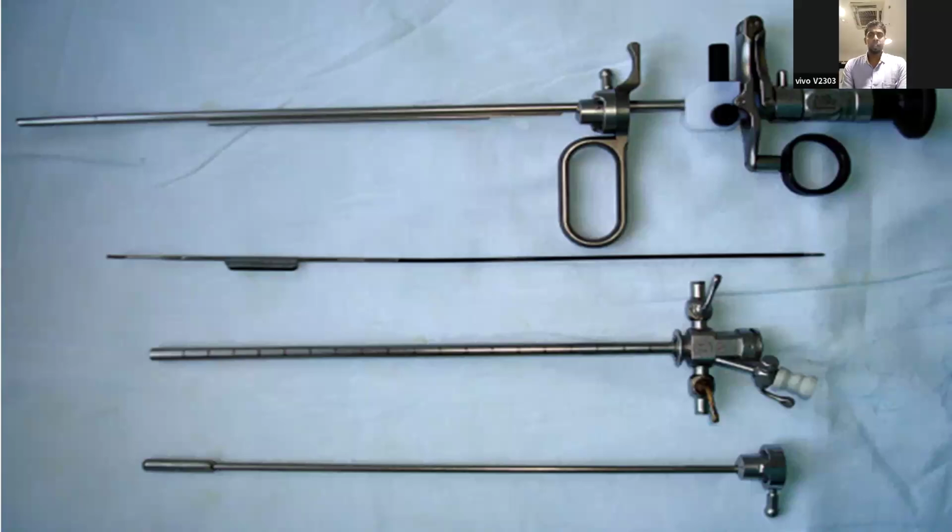Sir, the active working element is the Iglesias, and passive is Nesbit, sir. Okay. Then types of resectoscopes.